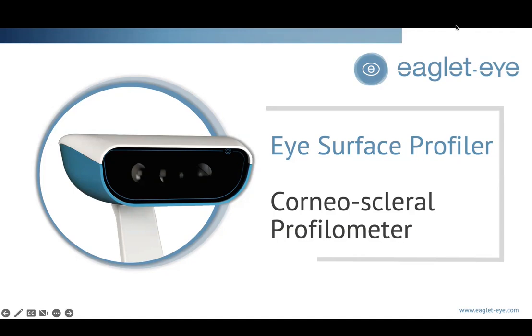Things have really changed. I want to go through some of the capabilities of the unit, how we use it in our clinic, and really share how it is a power tool for specialty lens fitters. It's very efficient and effective, and it is a cornerstone of our office.